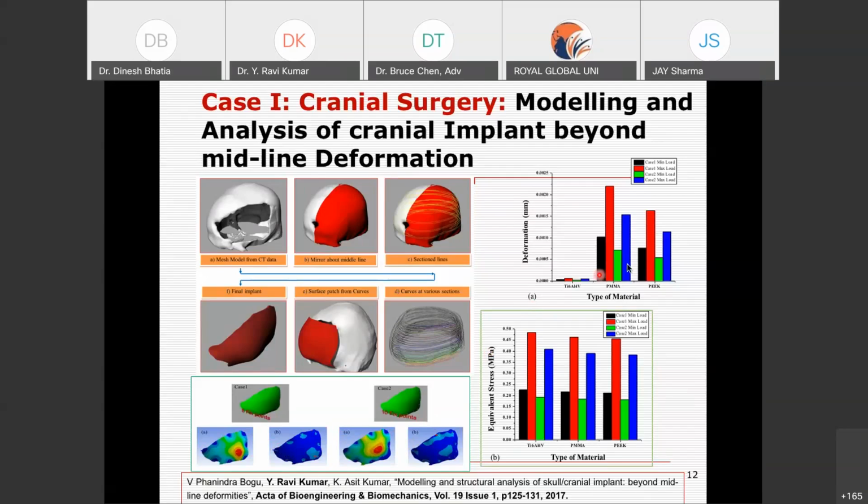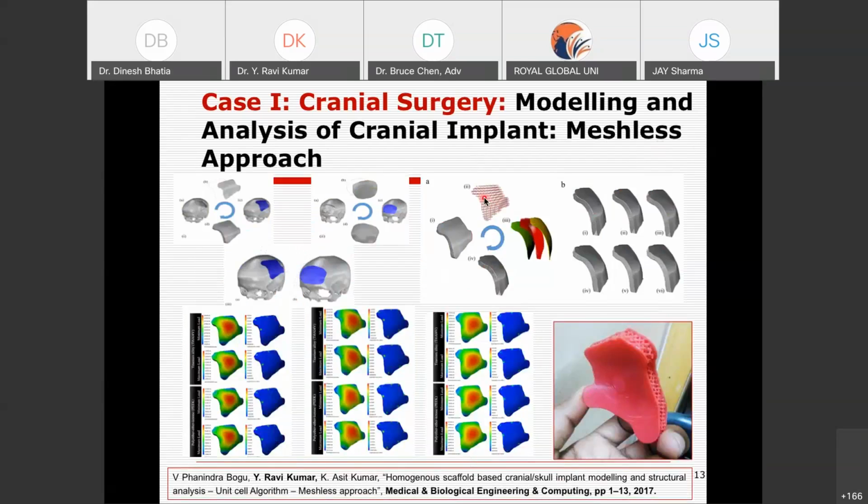As we know, there are limited polymer biomaterials which can be 3D printed. On the metal side, you may have titanium 6-4, and under the polymer group you have PMMA and PEEK. We have analyzed the properties that we are looking at. Finally, if you closely observe the anatomy of the skull, it is a kind of sandwich structure, right? You have the outer bone, maybe around 0.5 to 0.6 mm, and the inner bone, maybe around 1 mm, with different thicknesses. In between you have a sandwich, the porous structure, which is a lattice in nature.